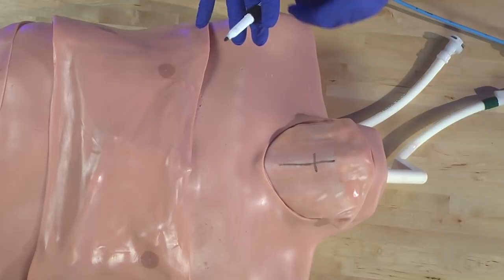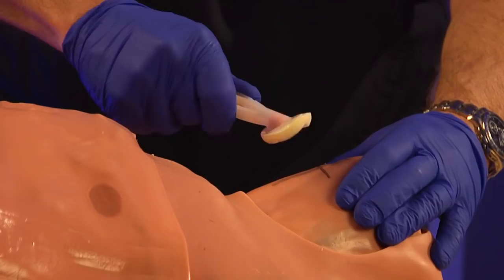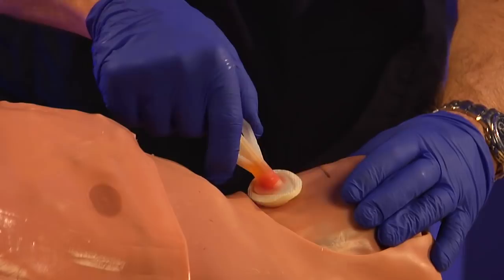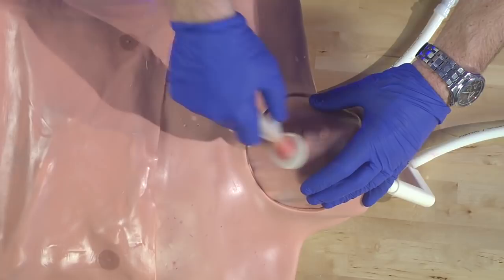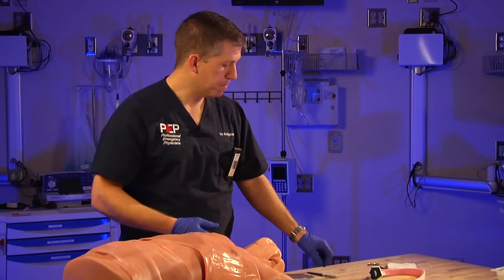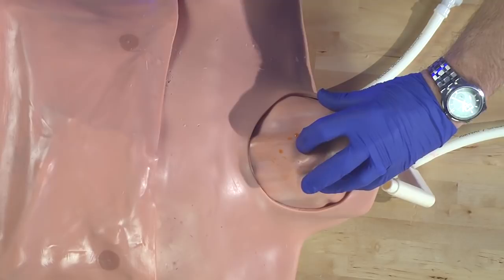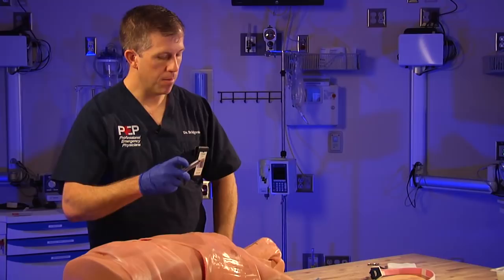We've failed from above — no longer able to ventilate, can't get a non-visualized airway in, can't use bag valve ventilation. We move to the surgical airway. Clean the area with chlorhexidine, betadine, or alcohol swab. You may inadvertently lose some of the landmarks you drew, so get your finger down there and hold that position while cleaning. I've already preloaded my endotracheal tube over the bougie, and I have that immediately available — my partner hands it to me or I pick it up directly.